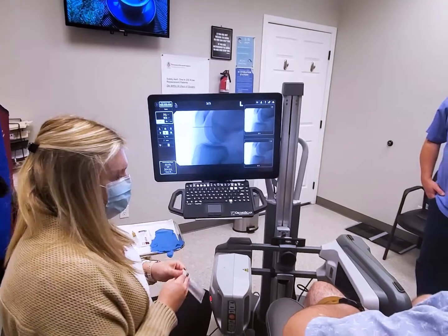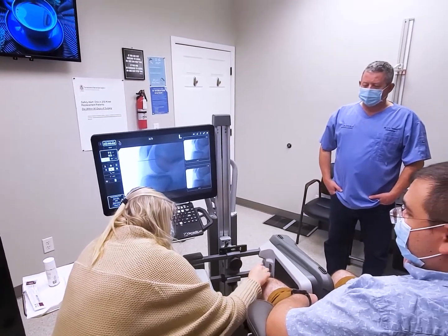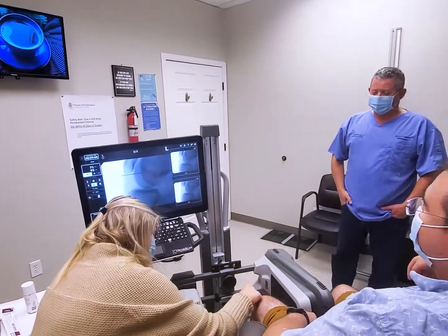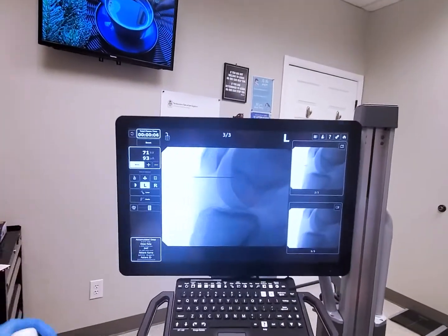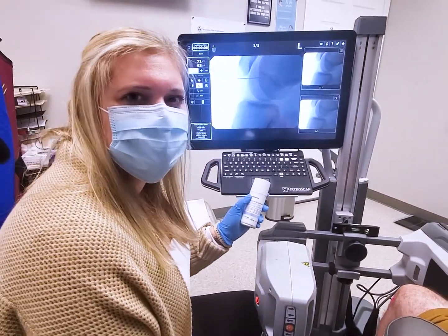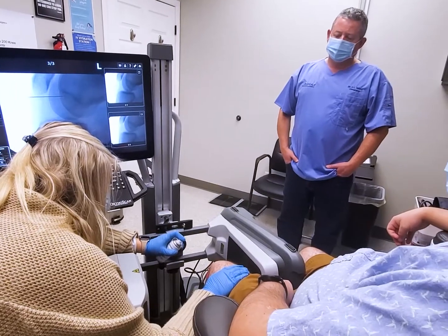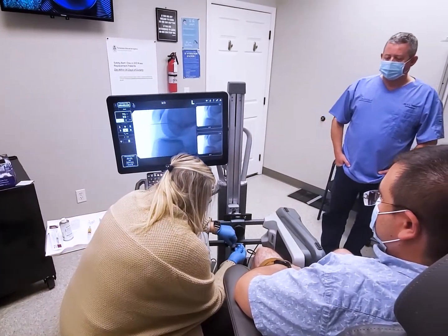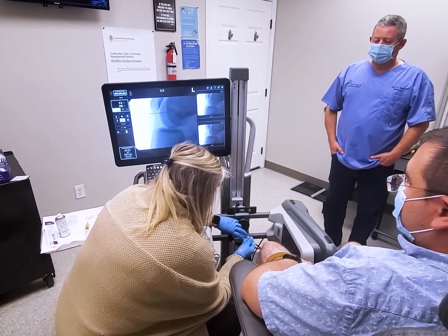Next step is we clean the area. We have nice relaxing jazz music up on the screen. Okay, so this is the coolant spray that we use. This topically numbs the skin just so that the first puncture of the needle isn't as bad. Next, the first thing I inject is a little bit of lidocaine. This just helps numb the area for the needle passing through.